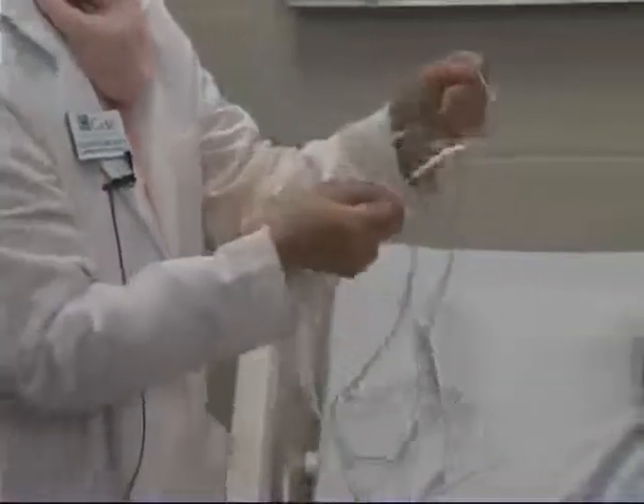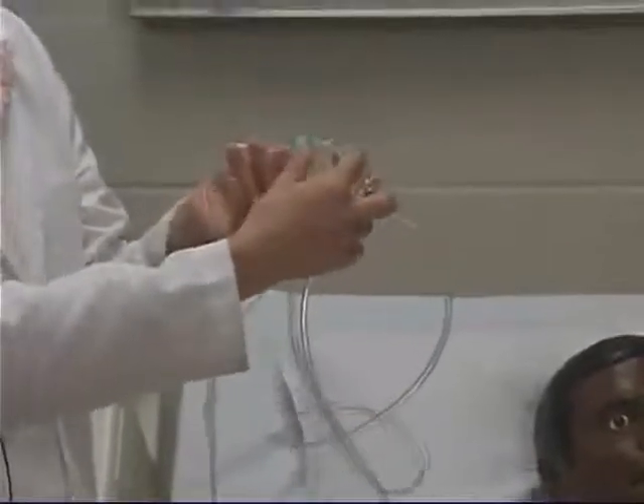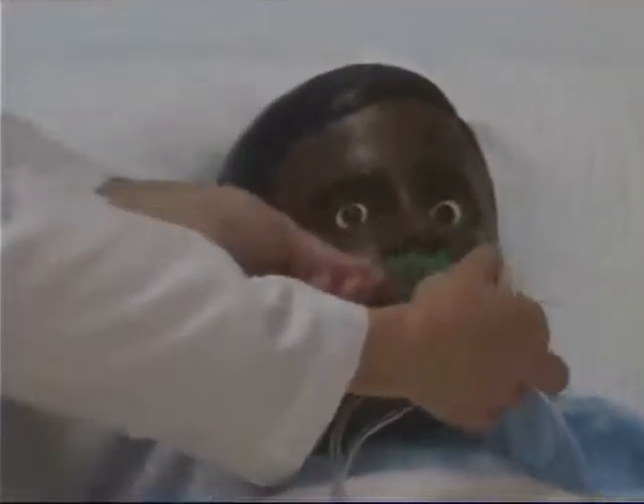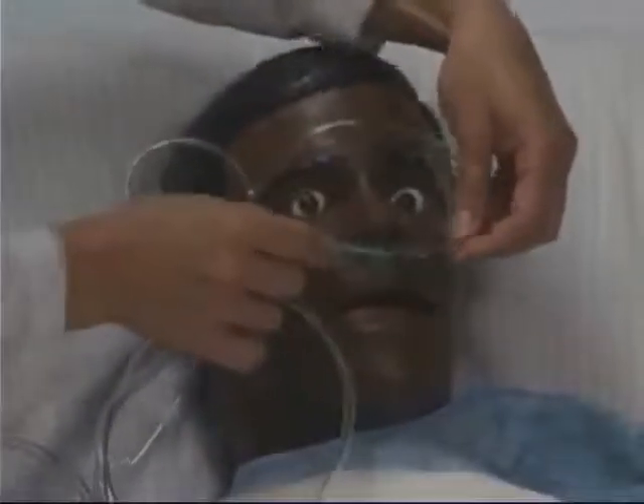The way we put this on the patient is these two prongs — this is where the oxygen is going to be coming out and going to the patient. These two prongs get placed in this direction, not the opposite direction. They're placed where the prongs are arched towards the back of the head of the patient. Each one is placed inside one of the nares, and this tubing you can slide to tighten or loosen.